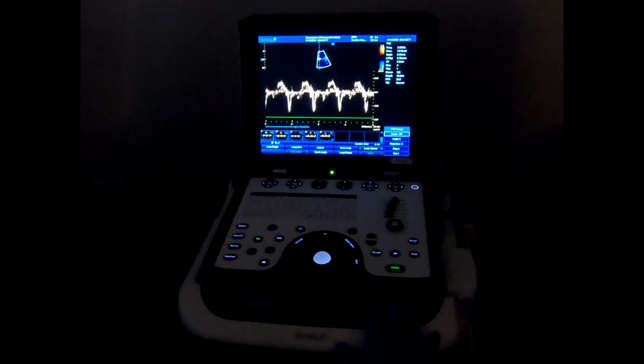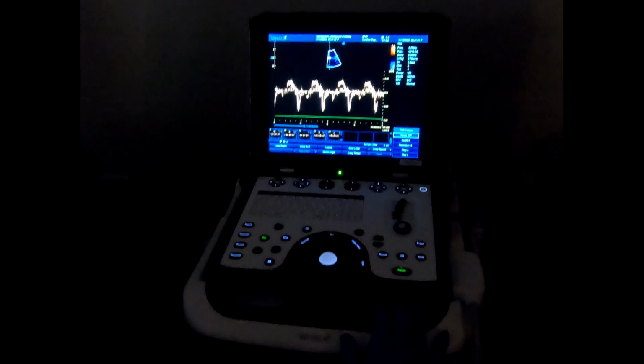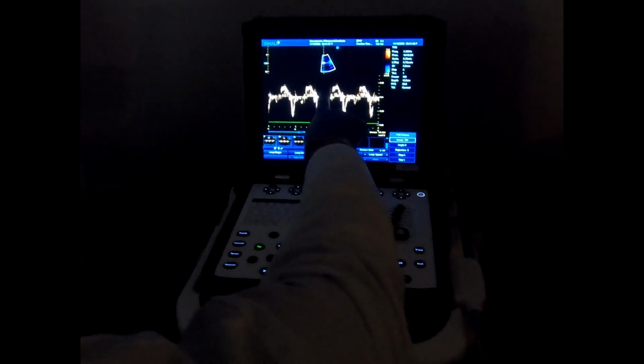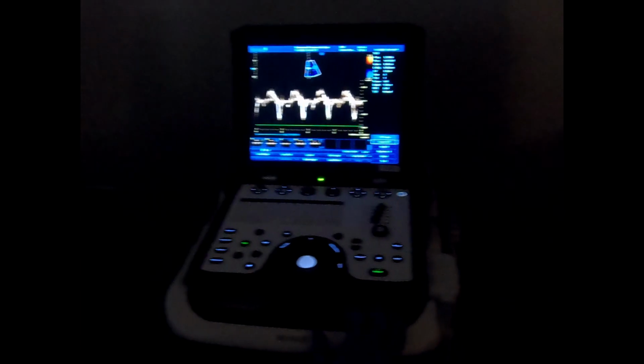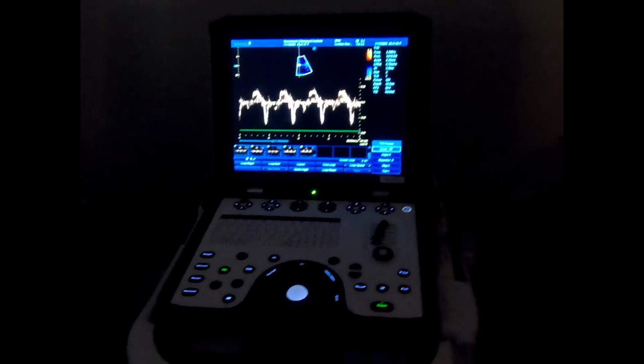Now if you have that situation that I told you is very rare, where you have an S1 and S2, it sounds like you have one like that. You need to go with the highest velocity, and most of the time that's your S2, not S1.